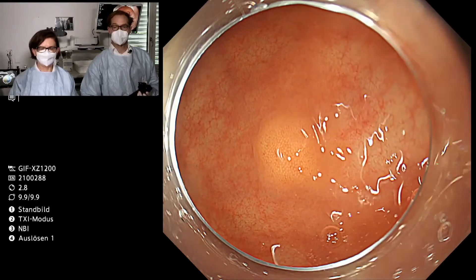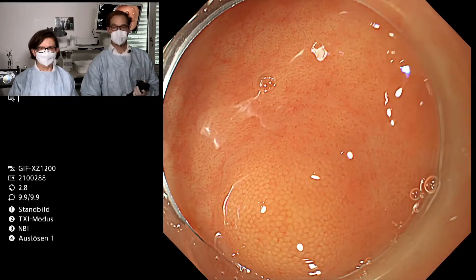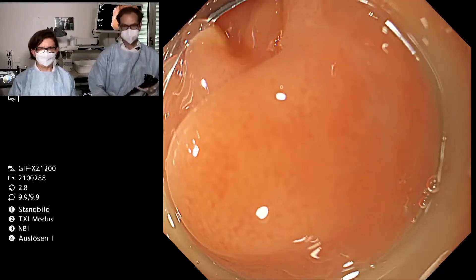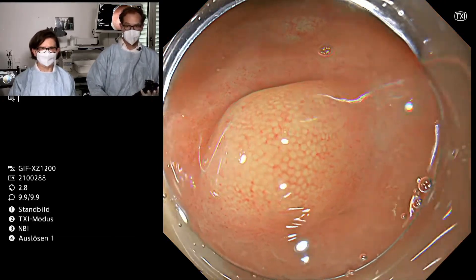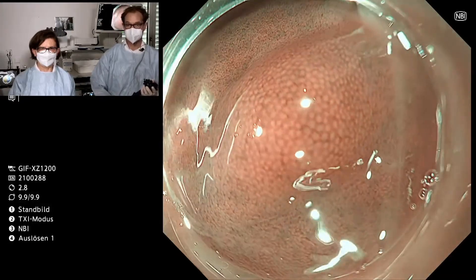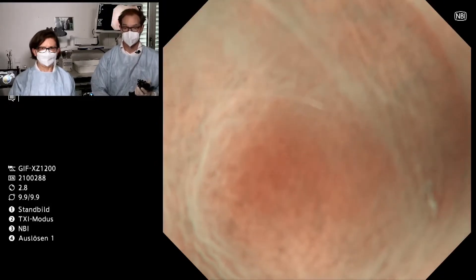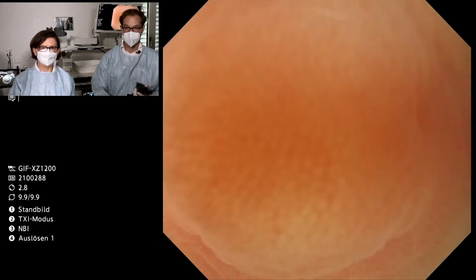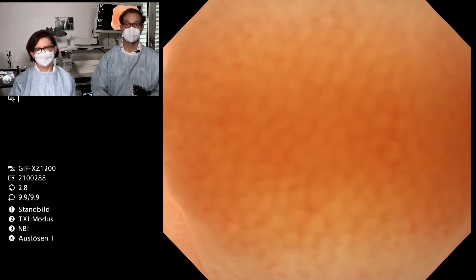With the zoom endoscope I can demonstrate an even closer look on the mucosa. Here you can see nicely the pattern of the normal colon mucosa. Turning on TXI, it's an absolutely normal colon pattern. And even with NBI you can see it nicely. I zoom in further to show the full magnification power of this endoscope.